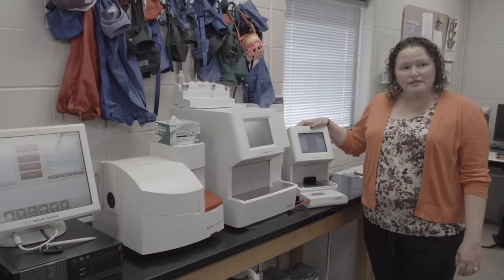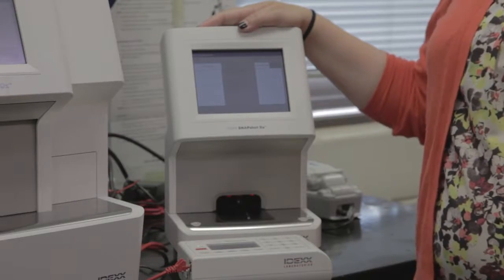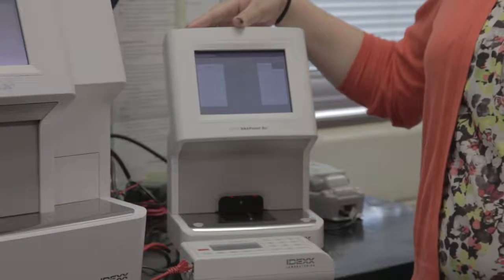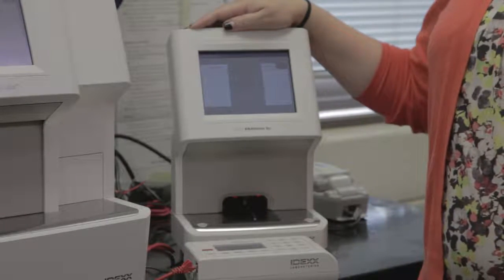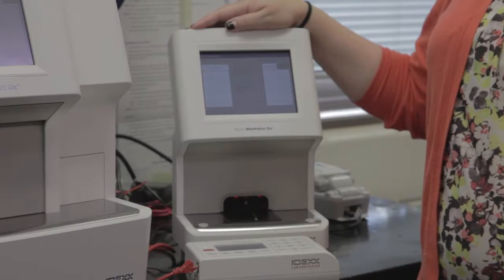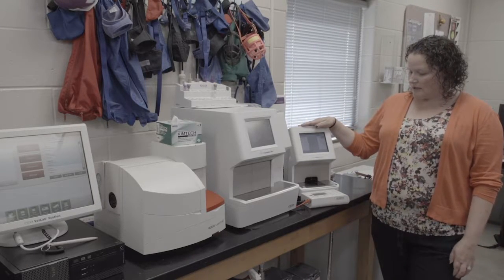This analyzer here, this is the SNAPshot. This is where you're going to run your bile acids and cortisol, but then you can also use this to run any of your snap tests, such as heartworm, feline triple, and any of those other tests that you would want to run in this SNAPshot.